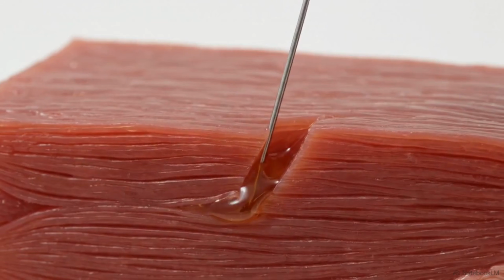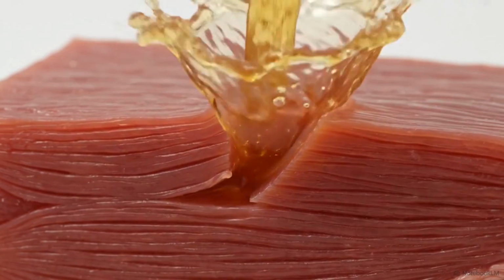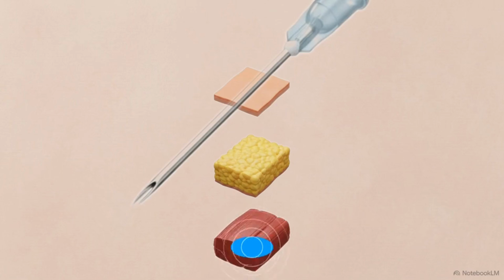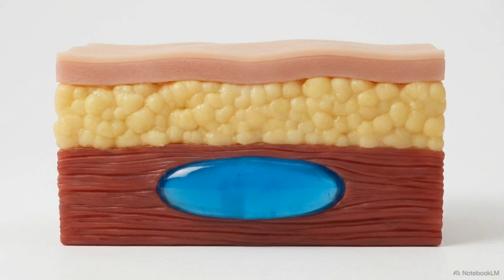Removing the needle too quickly releases internal pressure that forces viscous medication backward through the puncture track and out of the muscle. Waiting the full 10 seconds gives the fluid time to begin dispersing into the muscle fibers, equalizing the pressure at the needle tip. This mandatory pause ensures the medication remains where it was intended and the patient receives the full therapeutic dose.